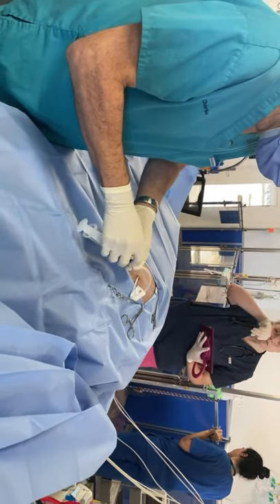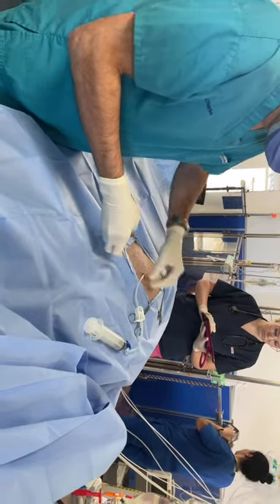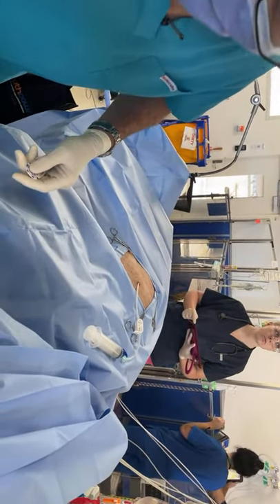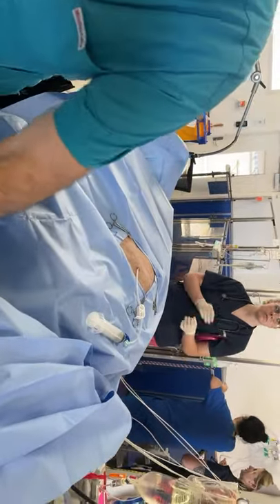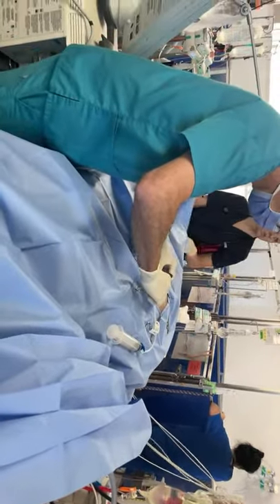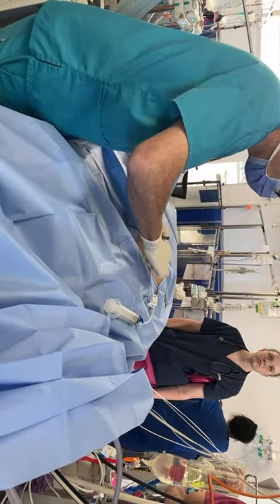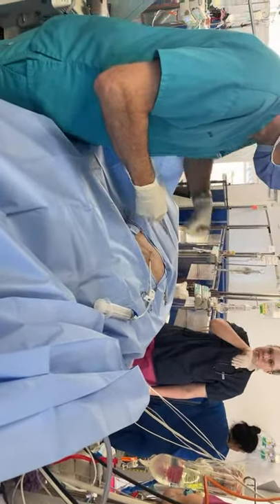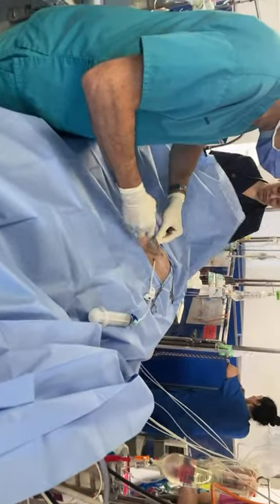I'll pass this white clip — which is from intravenous or arthroscopy tubing — then apply the syringe back on. Now that I'm confident I've occluded the tube, I can remove the hemostat. I'm going to do a cruciate suture, because sometimes air can leak underneath or through the skin incision and back into the chest cavity around the tube, so I always put in a cruciate suture like this.